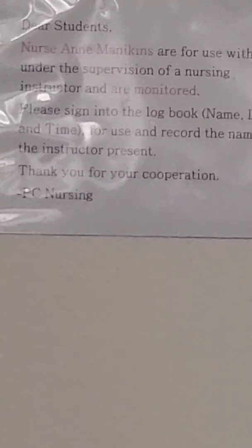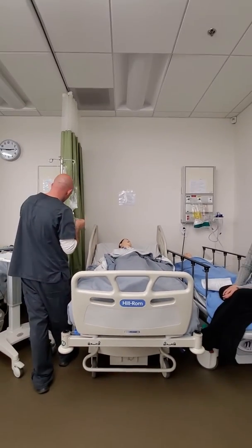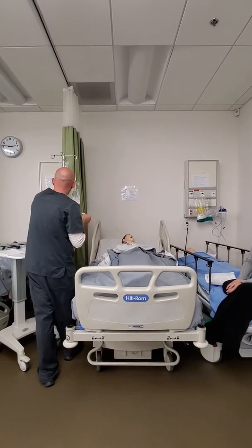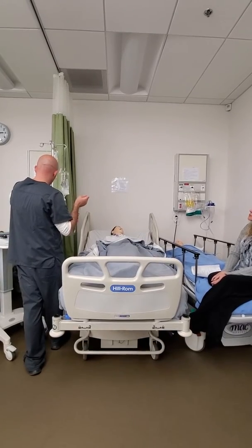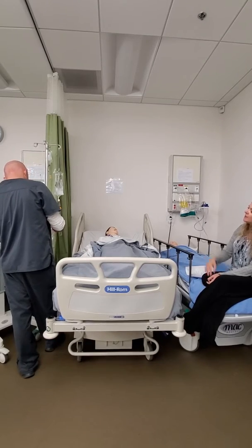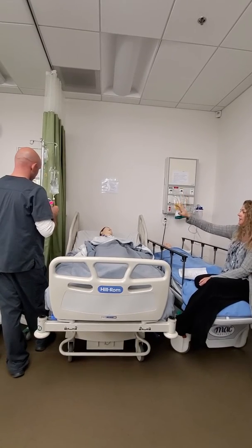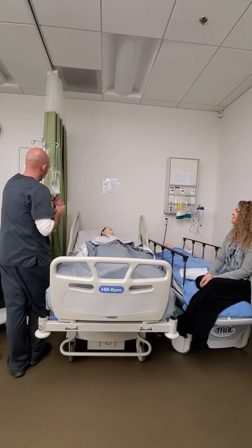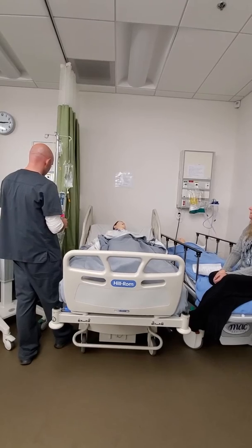Actually, what I wanna do is purge this line of any excess residual med. How do you want to hold the bag? I wanna invert this, but I wanna open up all the lines. They're already open. Okay. Well, not this one, not that one. What's happening in your drip chamber right now? So I'd wait to open up your secondary clamp until you're ready to start the purging, because you opened it and then you were looking all over here, and in the meantime, it's back flushing. Okay, cause it's coming through there. So once I have it lowered below this bag, it'll drain by gravity, then I can open this clamp.